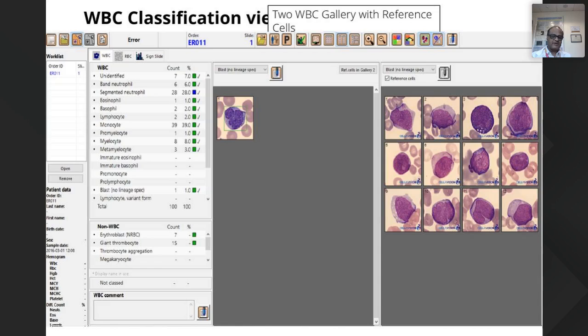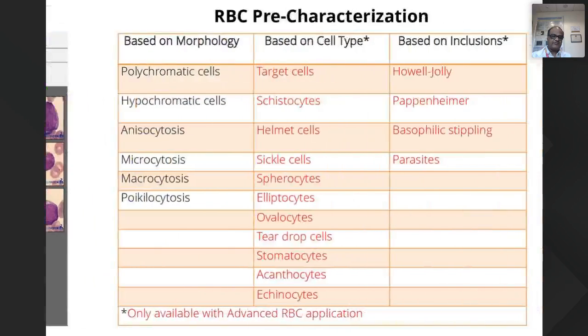There is a reference image atlas also given in the software where you can check whether you have correctly identified the picture here. So the blue things, the blueprints that you get in the small tiny dots, are compared with the reference images itself.